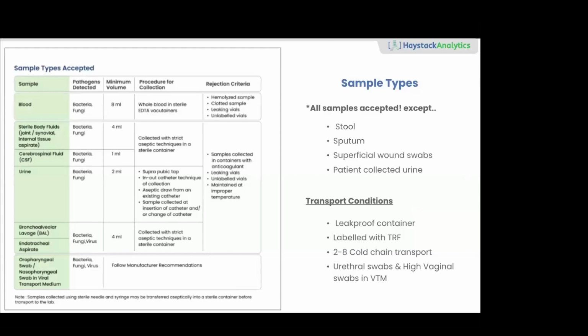I think sir has made sure of it in all his samples from day one. The way sir collects the patient samples, I have not seen a background noise of commensal flora. I'm very happy, because even in culture we will be able to pick out contaminants or commensals of a higher degree, but the sample collection is immaculate when it comes to what we have to put into this particular test.